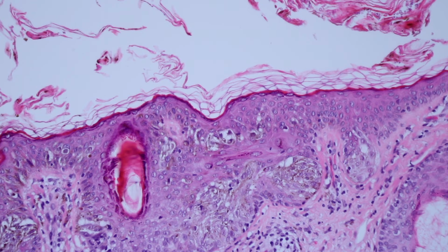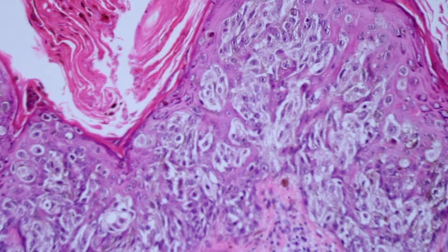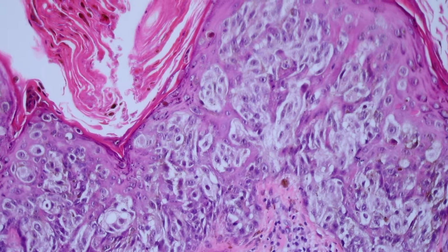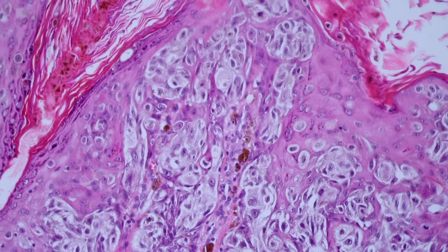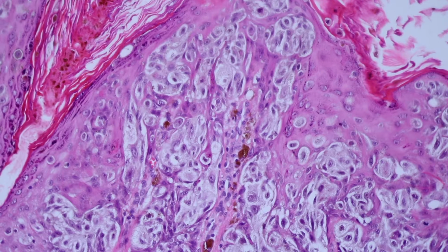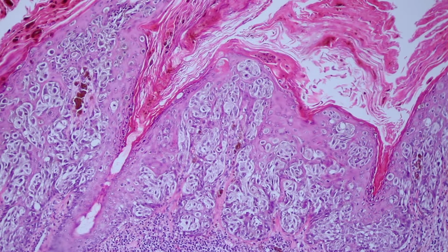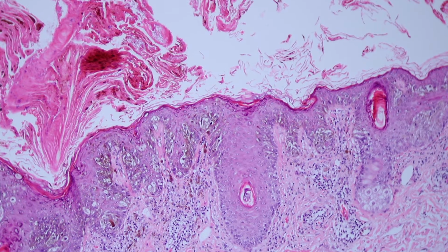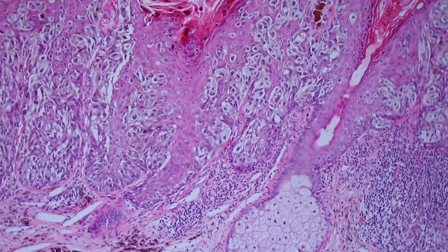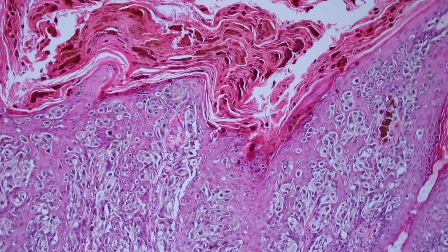So if you think it looks perfect for a nevus and there may be 1 or 2 pagetoid cells in the middle, well, that might be just an irritated nevus, or acral nevi on acral skin sometimes have pagetoid spread. And so do Spitz nevi sometimes, and Reed nevi. So again, there are lots of exceptions, but when you see tons of pagetoid spread, when you see pagetoid spread at the periphery of the lesion, those are worrying signs for melanoma, okay? And again, that's why I selected this case, because it's an unbelievable amount of pagetoid spread.